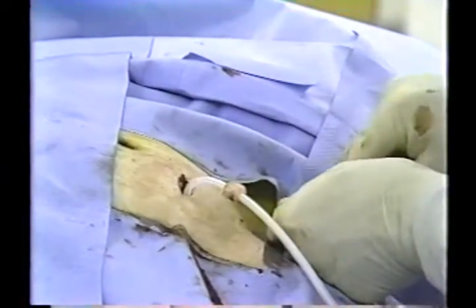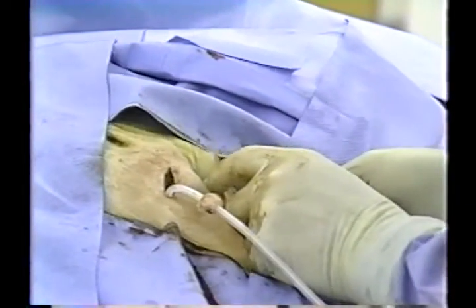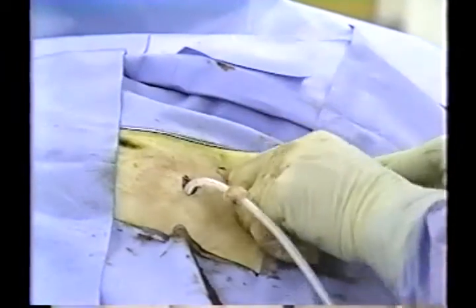The tunneler is then advanced through the stab incision to the primary incision site with a specially designed tip protruding out of the primary site.